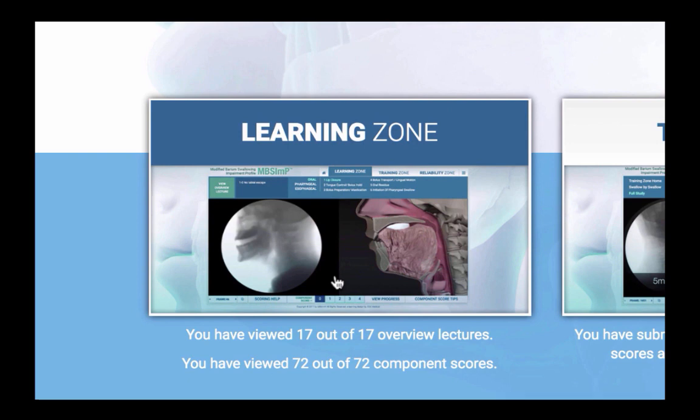This zone establishes the physiologic foundation of swallowing function and impairment that underpin the MBSImP. An overview and rationale for the development and implementation of the MBSImP is provided. Utilizing instructional videos and video fluoroscopic examples paired with custom swallow physiology animations, learners are systematically taught the 17 physiologic components and standardized impairment scores associated with each that together comprise the MBSImP scoring metric.